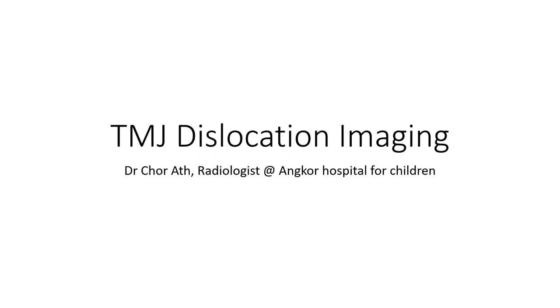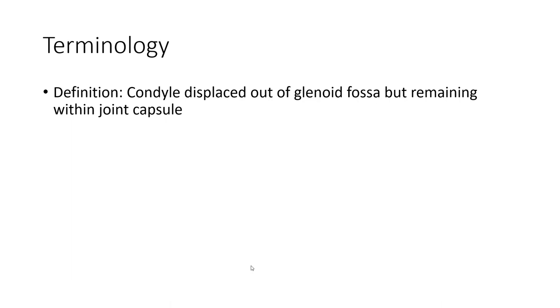Hello everyone. Today I'm going to show you about TMJ dislocation imaging. TMJ dislocation means condylar displacement out of the glenoid fossa but remaining within the joint capsule.